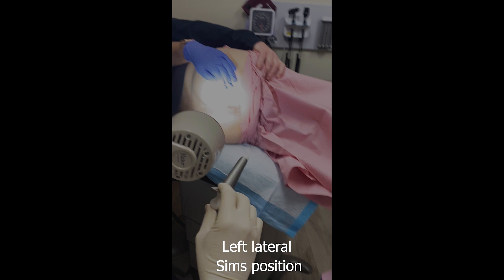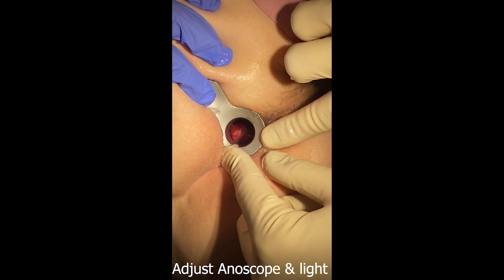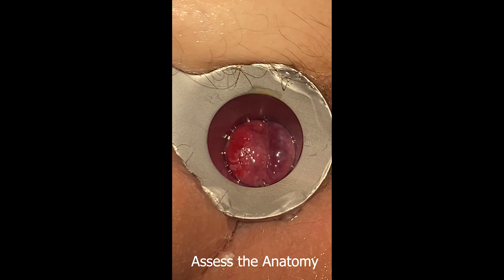The patient is placed in either the left lateral Sims position or the prone jack-knife position. Introduce the anoscope with a slant towards the target hemorrhoid. An adequate light source is important for clear visualization. Here we can see a clear delineation, which is the dentate line.